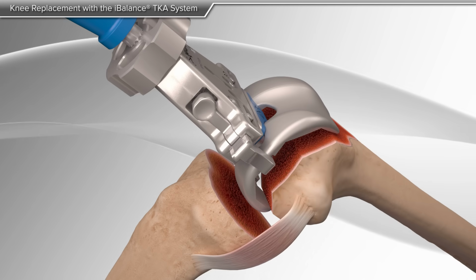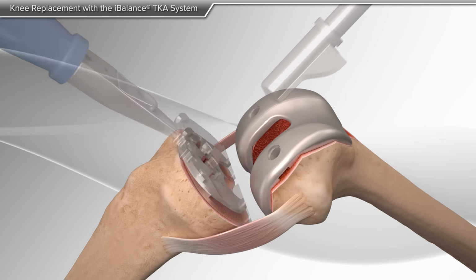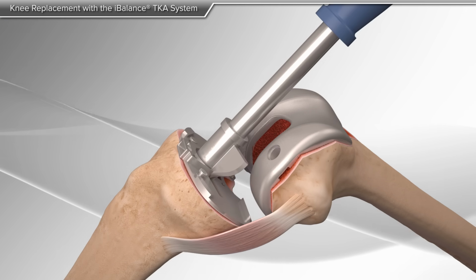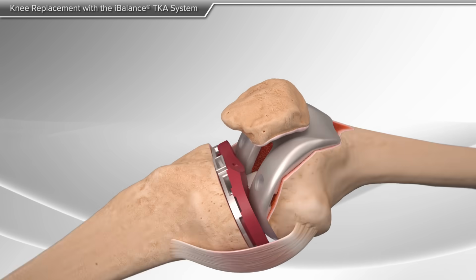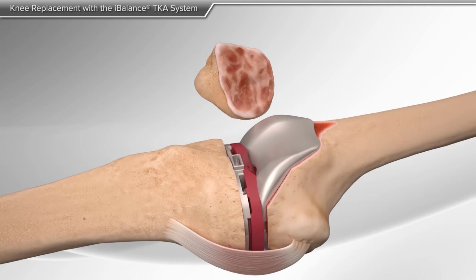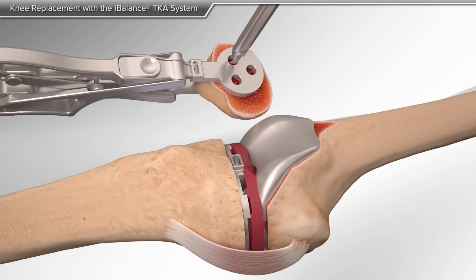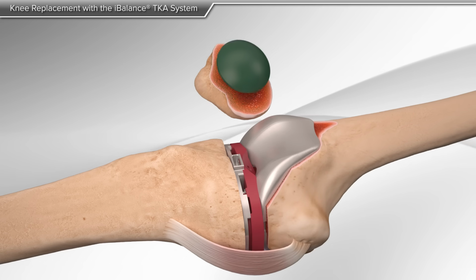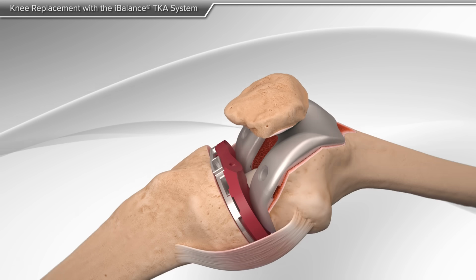The final tibia preparation is completed and a trial spacer is used to confirm knee stability. Next, your doctor prepares the patella to accept the implant. A trial implant is placed on the patella and the knee is checked for proper implant size and stability.